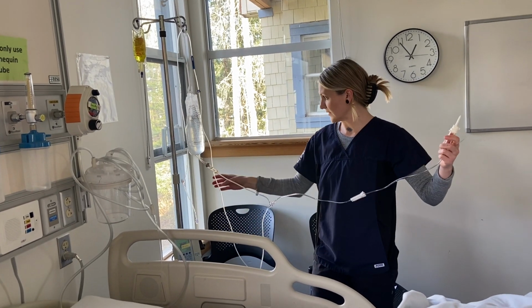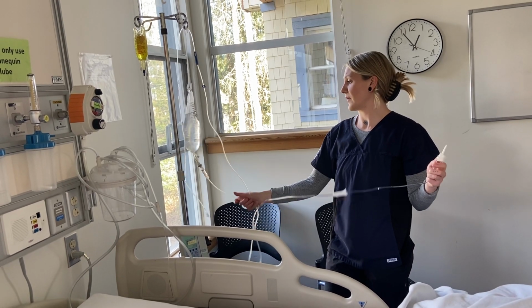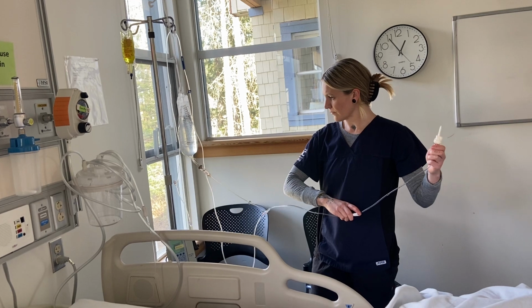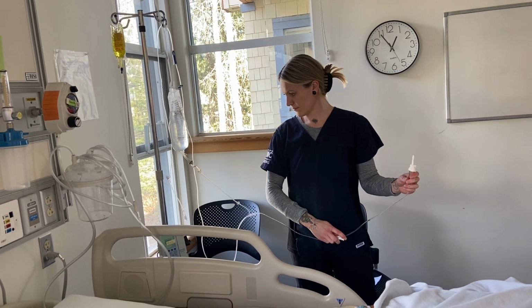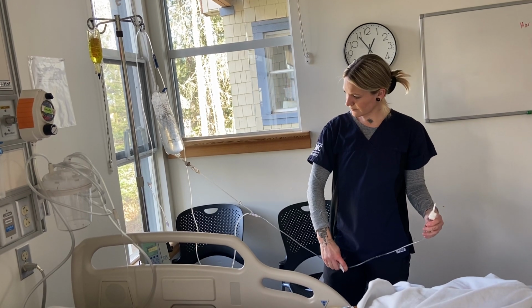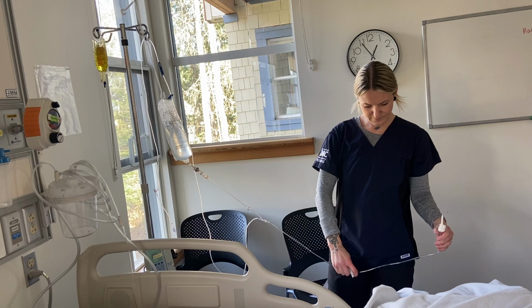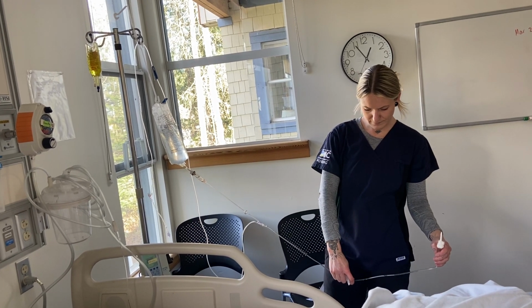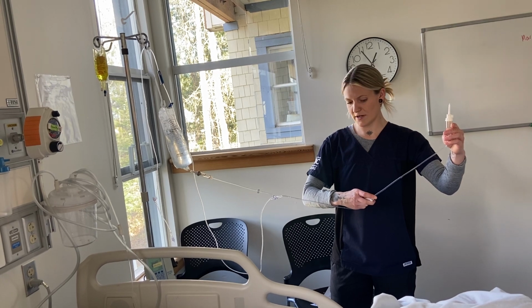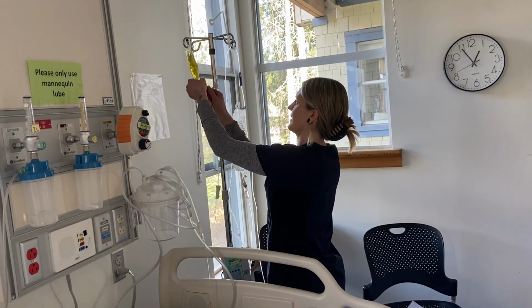Okay, the next thing I'll do is just prime my secondary line with the primary. Okay, and I don't see any more air bubbles. So then I can spike it.